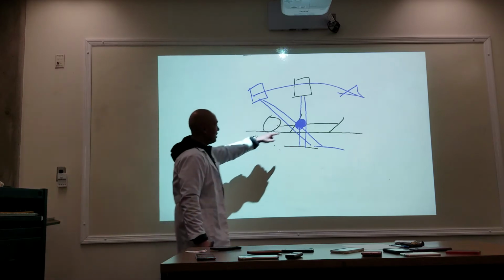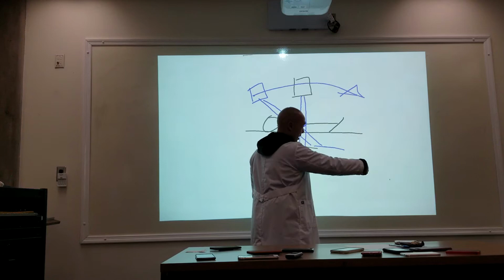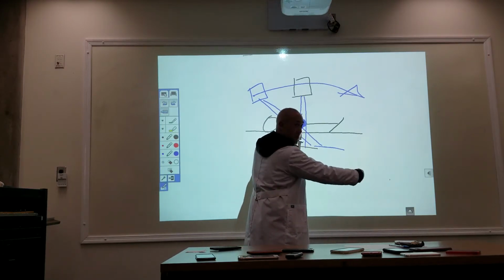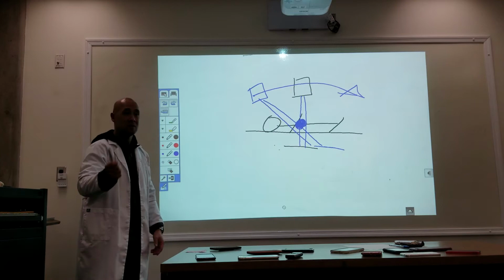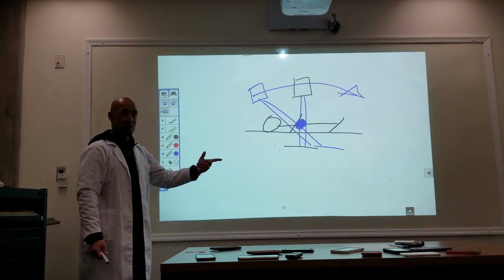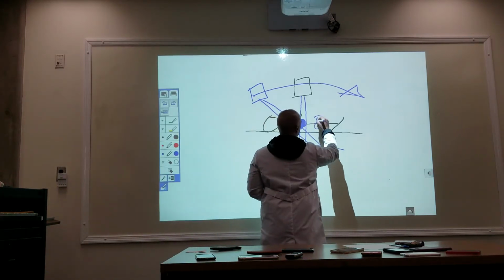And remember, I said that you can adjust that. It's a switch that you just go up and down. It's automatic. Go up, the fulcrum goes up. Go down, the fulcrum goes down. There's just an adjustable button. If I was 24 centimeters, what is my fulcrum going to be? It's going to be what? 8. It's going to be 8 cm.